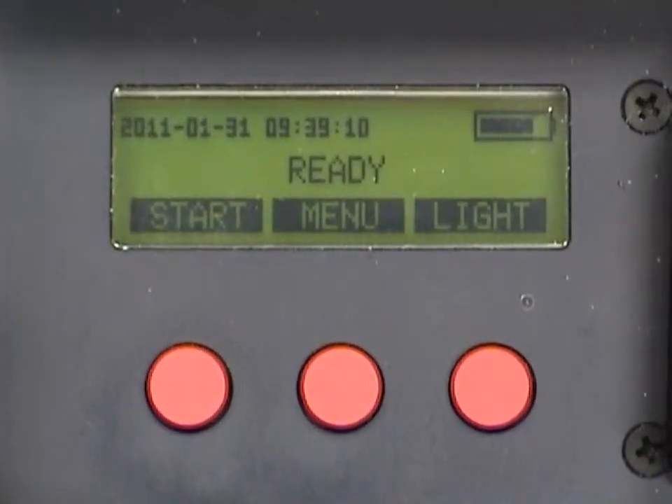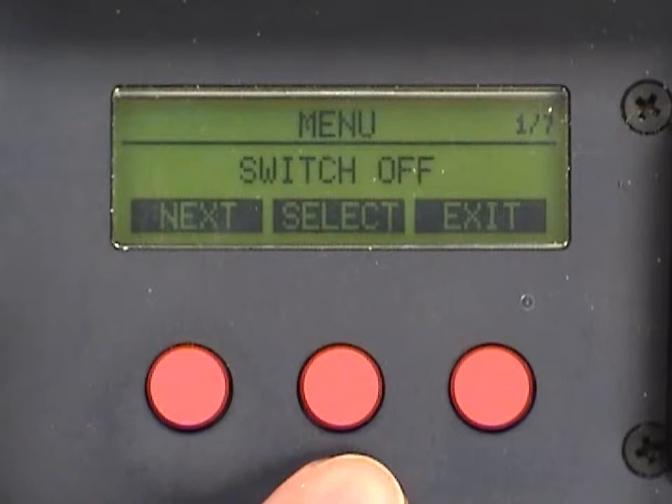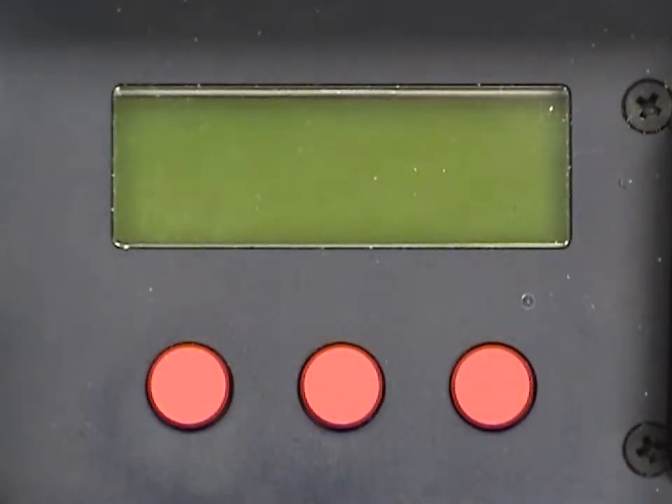To turn the RadLite reader off, press the second button once to activate the menu and then a second time to select the off option.